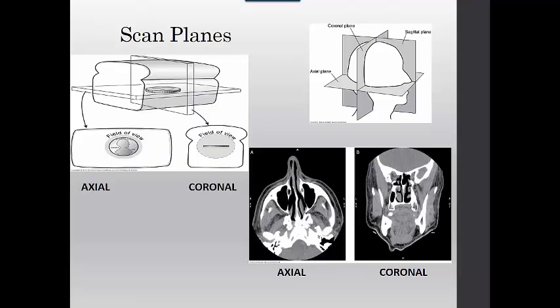So the decision of whether to scan an axial or coronal plane is based upon the difficulty of positioning the anatomy of interest. And this is the main reason that protocols exist and are fairly uniform throughout the field. The second indication for scanning in a different plane is to reduce artifacts created by surrounding structures. For this reason, coronal plane is preferred for scanning the pituitary gland.